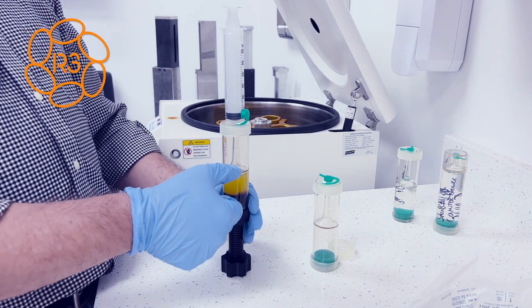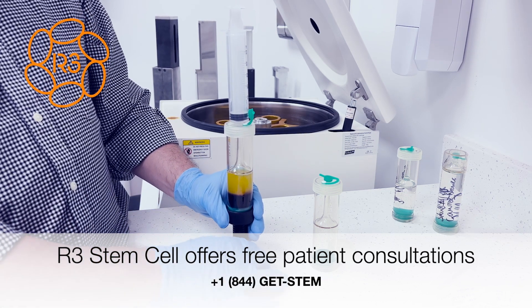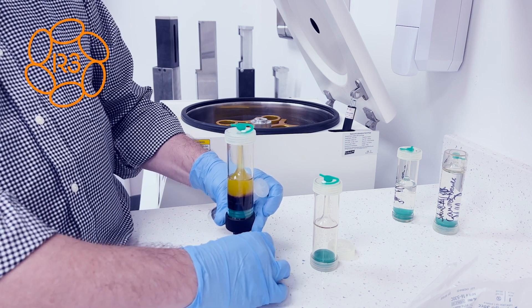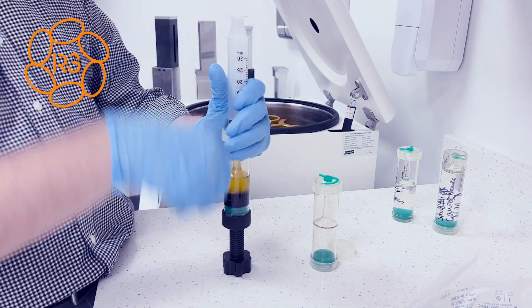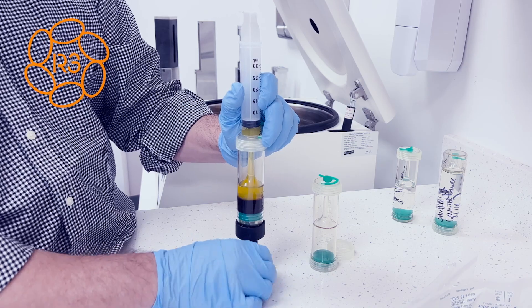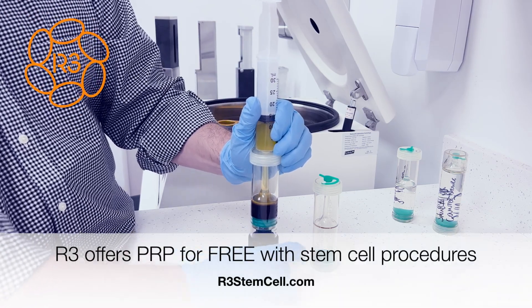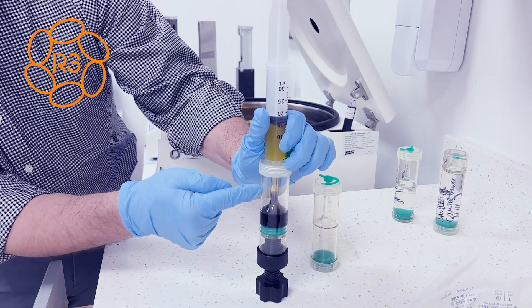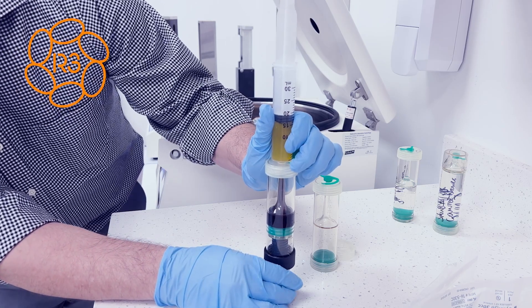So we have our PRP here, and we don't want the red blood cells. The way the kit works is you use this screw pusher, and what will happen is it will push up the PRP. Add the syringe — as you can see, PRP is coming up nicely into the syringe. This keeps pushing up. Now we need to be careful because the red blood cells are now coming up into the funnel there, and we want to get just to the top.